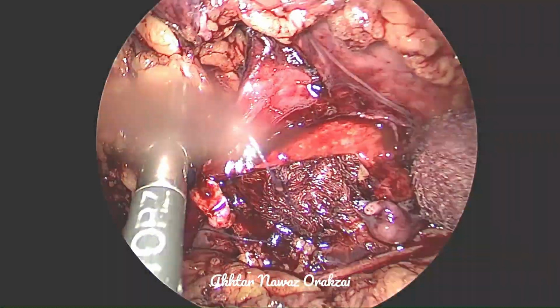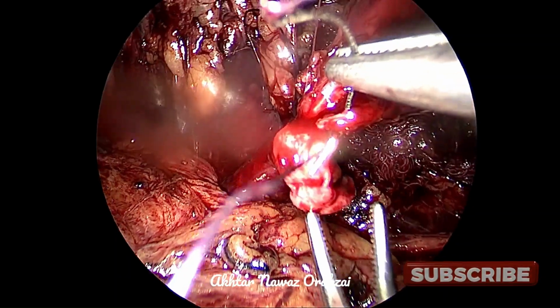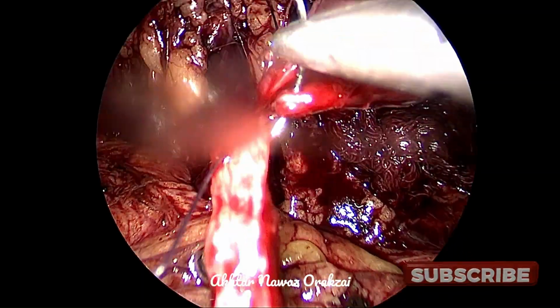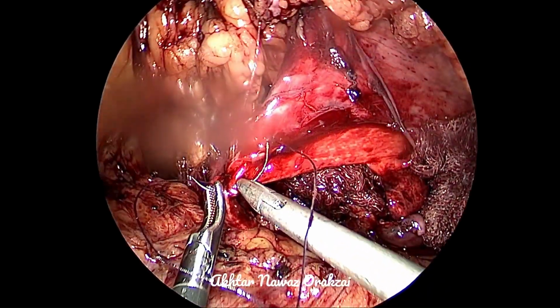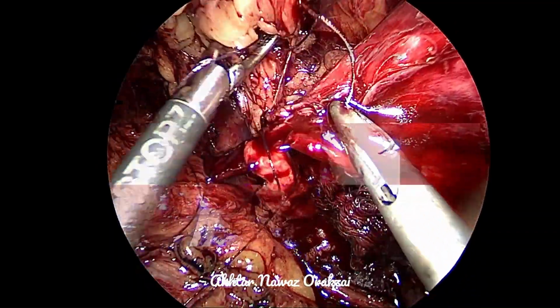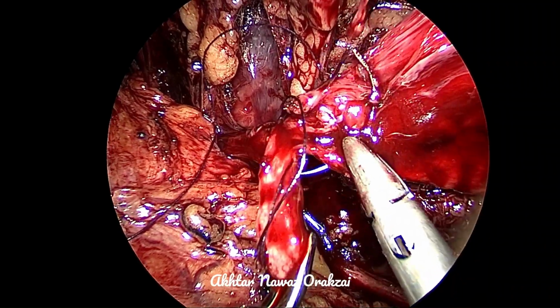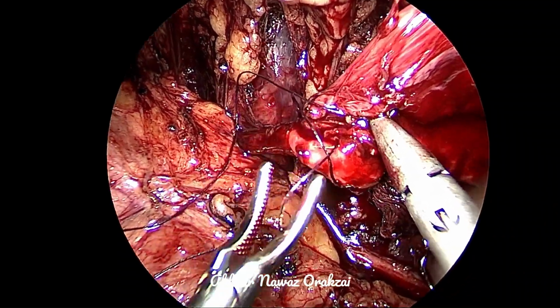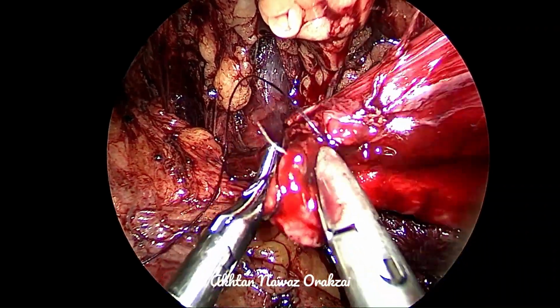So the Anderson-Hynes pyeloplasty initially was designed for the lower polar aberrant, the so-called aberrant vessels. However, it gained popularity over a period of time because it addresses the pathological segment as compared to other non-dismembered pyeloplasties, which do not address the strictured or the non-peristaltic segment. And so this form of pyeloplasty has got the best of results.